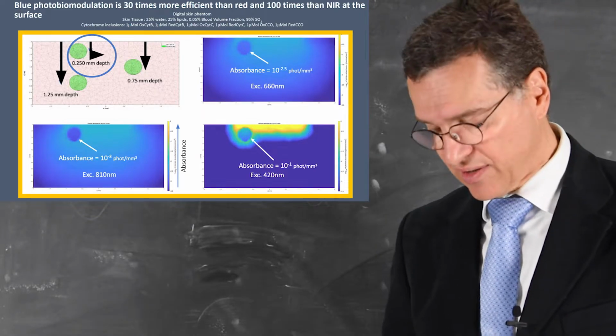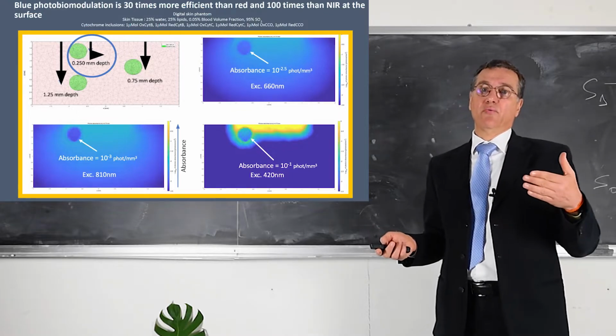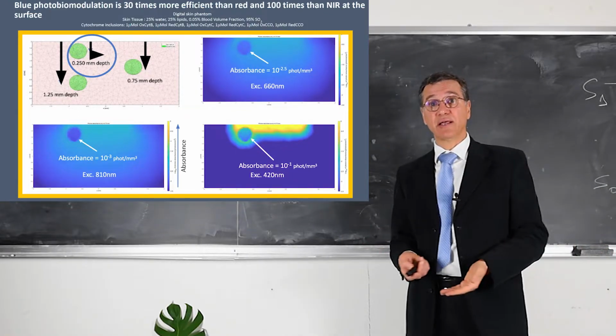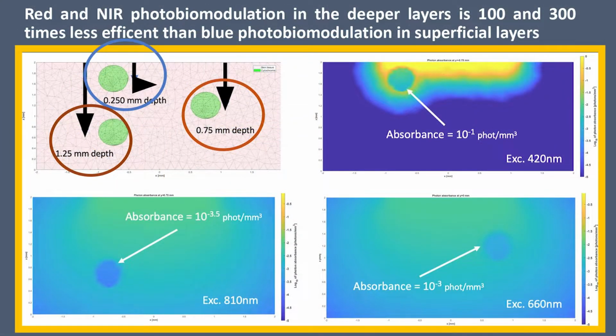Then you could say, okay, but we are interested also in going deeper. And everybody knows that red and near infrared go deeper. Correct. This is true.